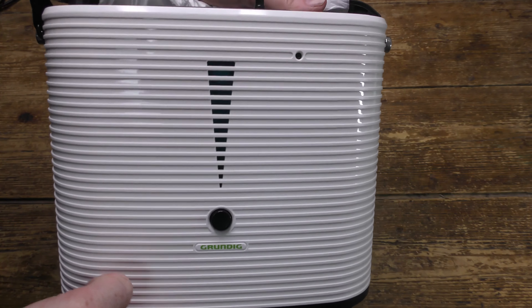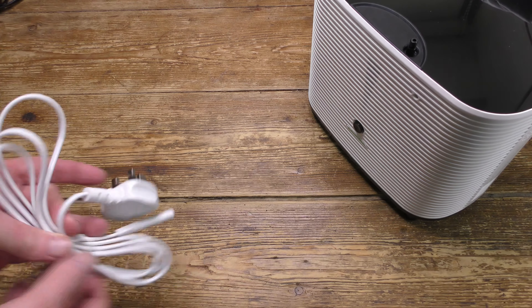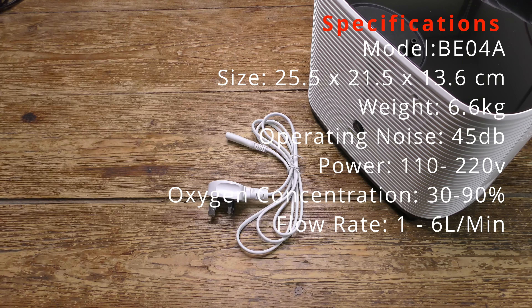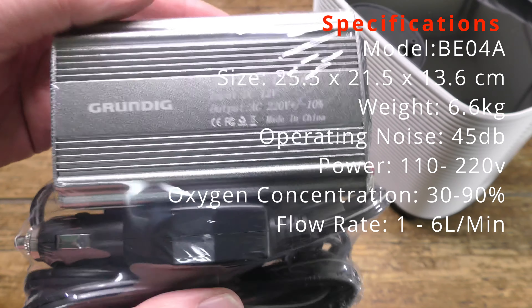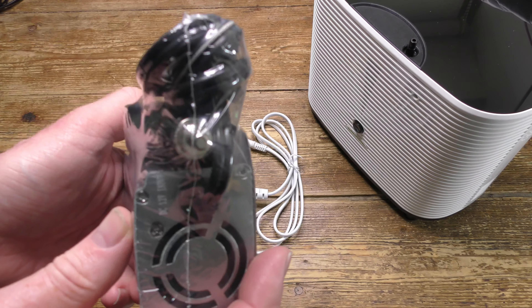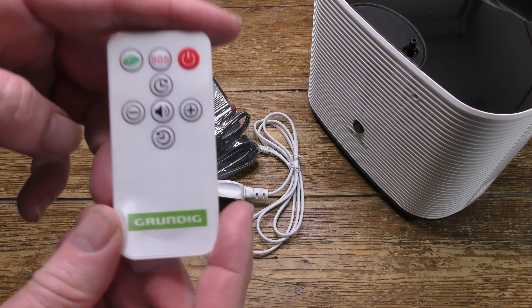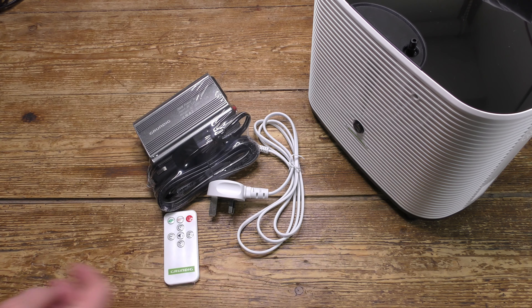Let's have a look now and see what else is in the box. Here's the UK power cable, but any standard power cable can be used with the appropriate plug on the end. There's the car power converter, all separately sealed up. There's the remote control, with all the key functions mirrored from the main unit itself.